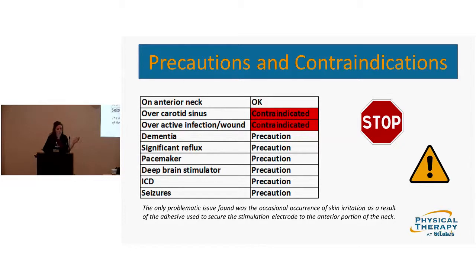And I remember this was a big question I wanted to ask, because head and neck cancer comes through my door a lot, and I really want good outcomes for these patients, so I wanted to use VitalStim. So according to recent research, VitalStim on head and neck cancer is now a precaution, not a contraindication.